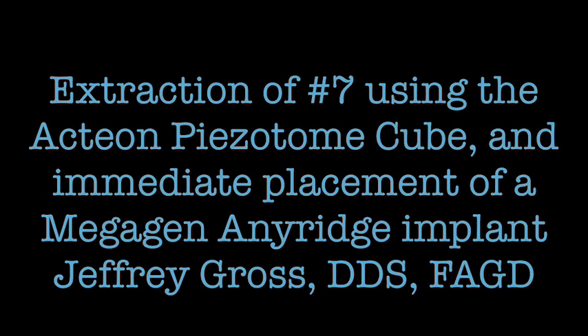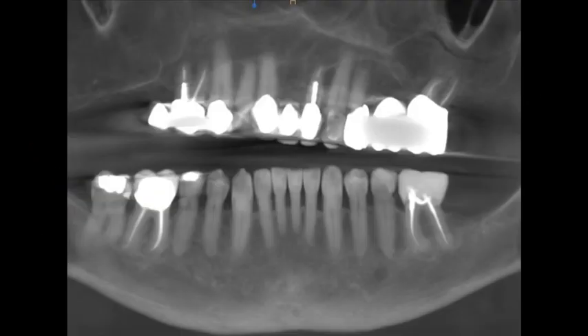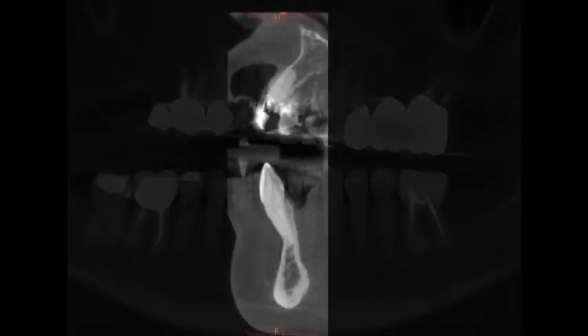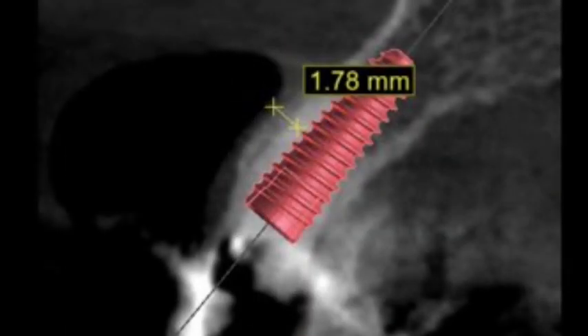The following video demonstrates the removal of number seven which was fractured at the gingival margin and the immediate placement of an implant. This procedure, which was formerly a challenge for many practitioners, is now predictable and repeatable through the use of technology.